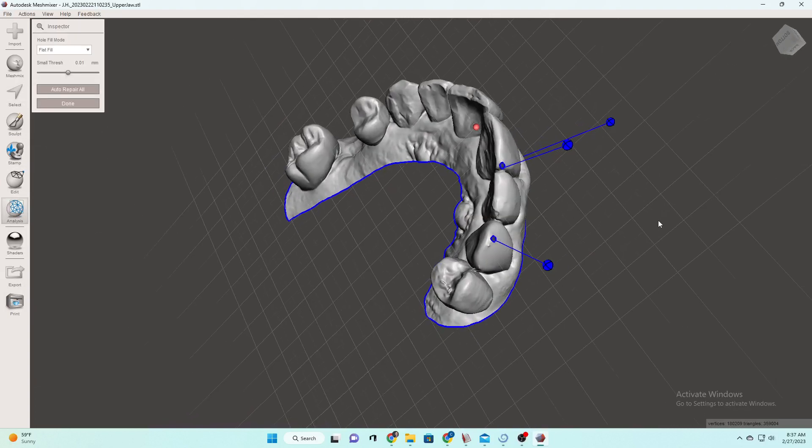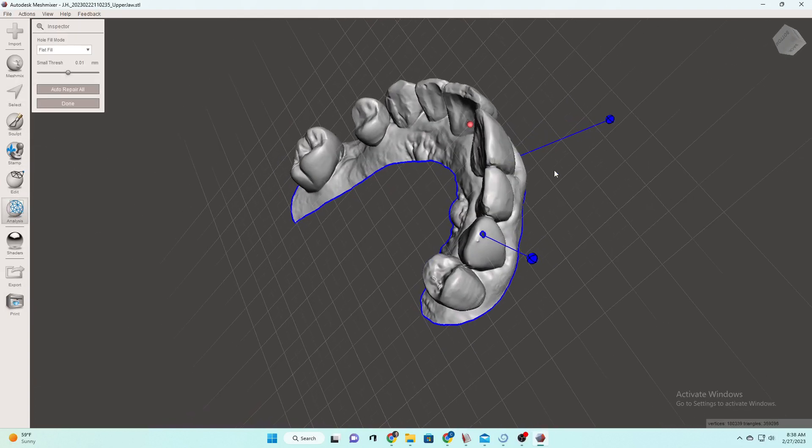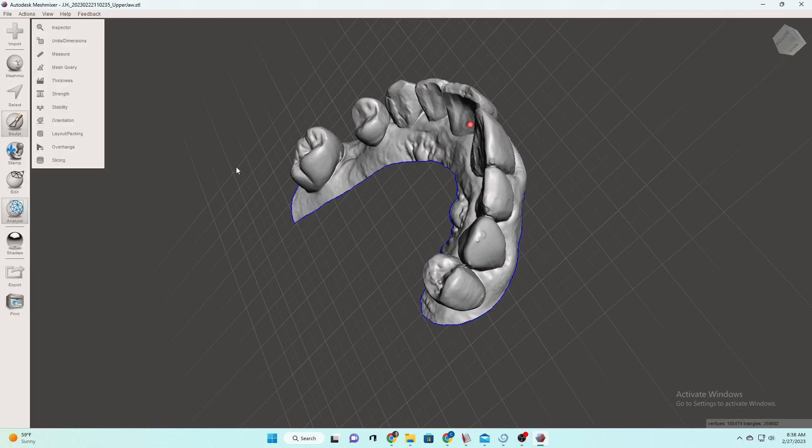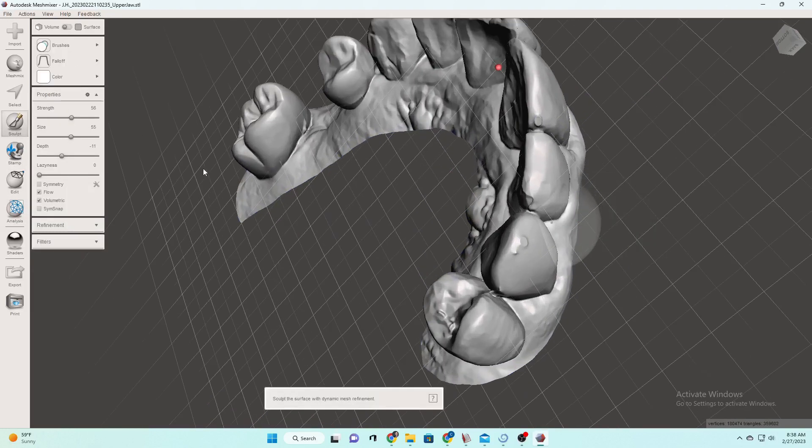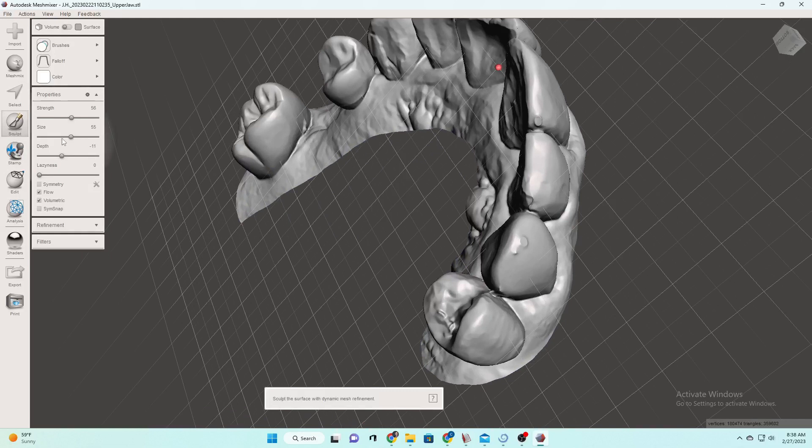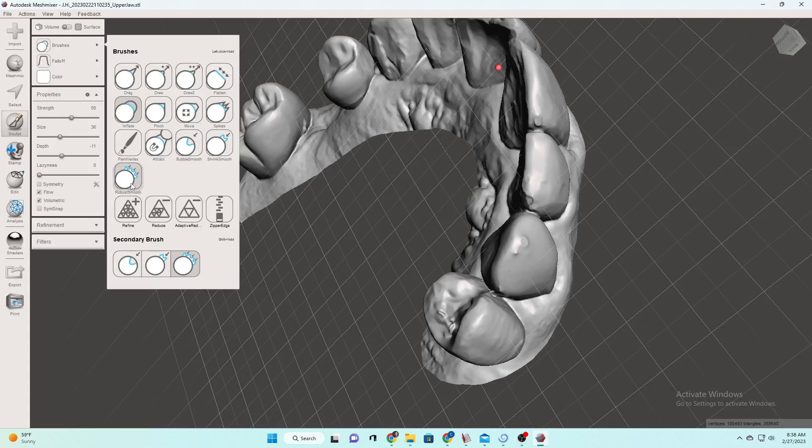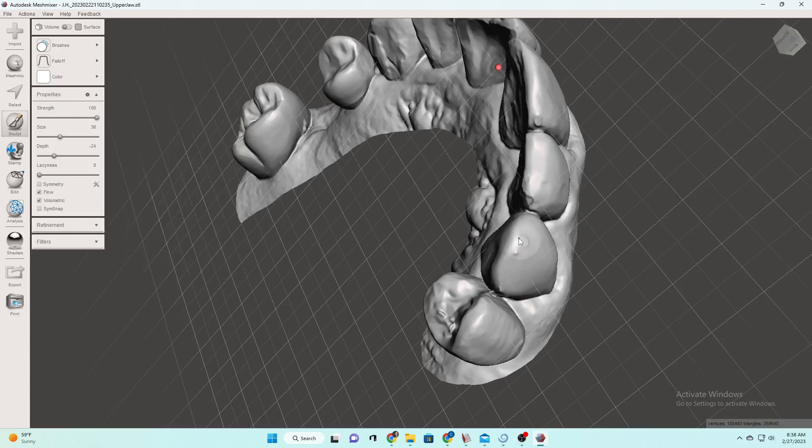So now we need to put a base on it so we can print it. But we do always have to do that inspector because that's going to show us any little voids or anything that'll give us problems. Inspector's like your best friend, if you do the inspector and the hole that it fills in is just a little wonky, you can smooth it just a teensy bit.